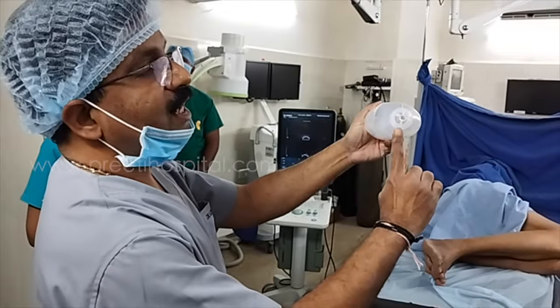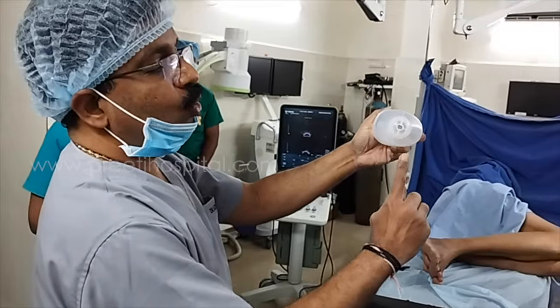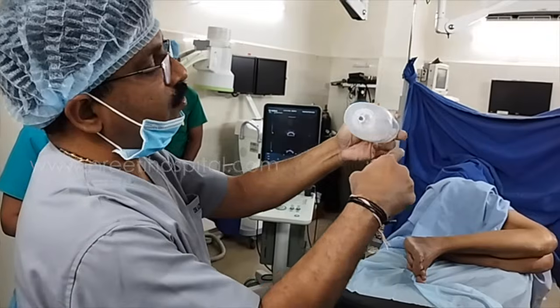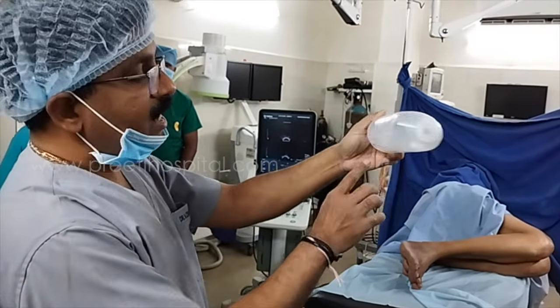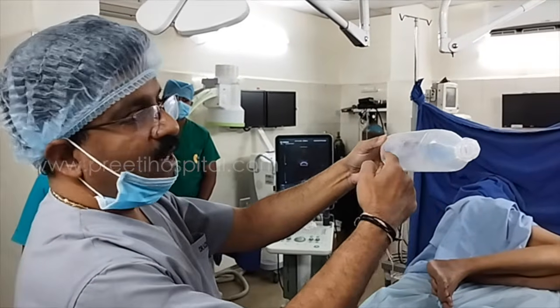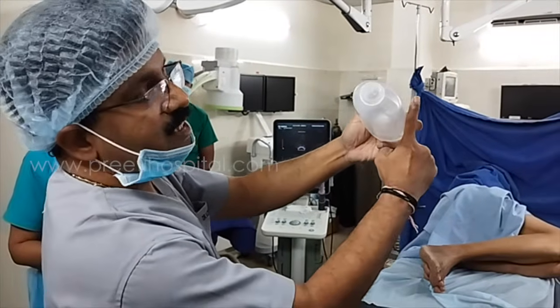We are traveling anteriorly so that most of the piece comes. In this part of the apex, we are going axial. 1, 2, 3, 4. In these two parts, we are going 1, 2, 3, 4. 1, 2, 3, 4. So 4, 4, 8 plus 4, 12. This is basic. In this part of the base, they said that a lot of tumor is there. So we have taken extra 1, extra 2 and extra axial. Here extra 4, extra 5.